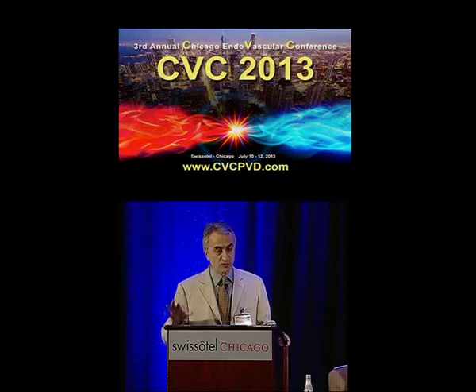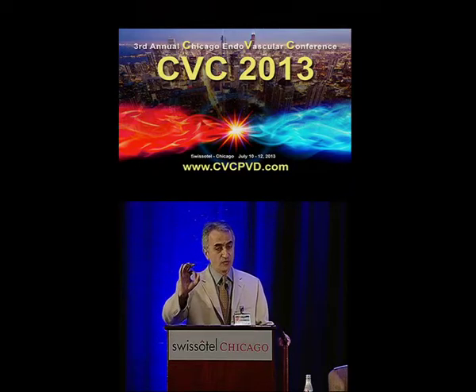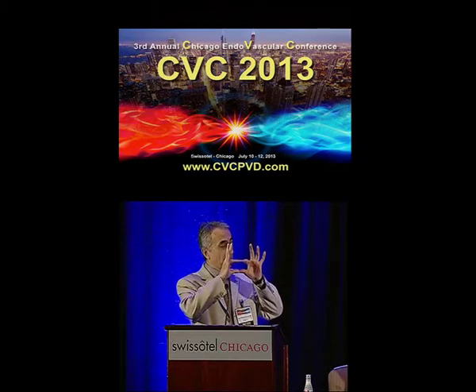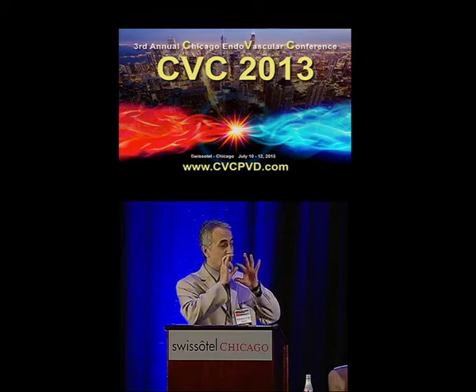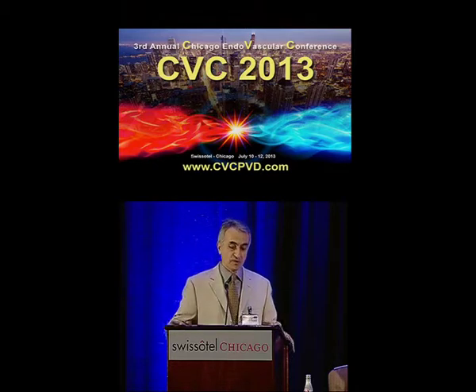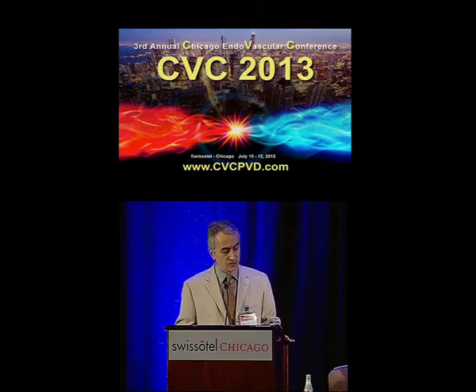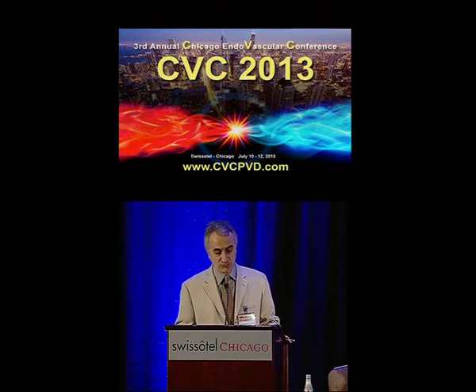Our results in terms of volume, diameter, and area of flow are that although nitinol stents collapse like this and wall stent doesn't, the area of flow is actually higher in the nitinol stents. But these obviously need to be addressed and flushed out a lot more.